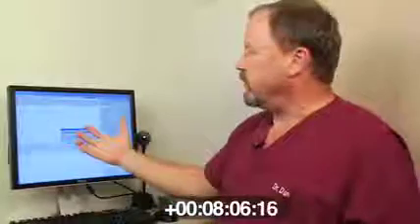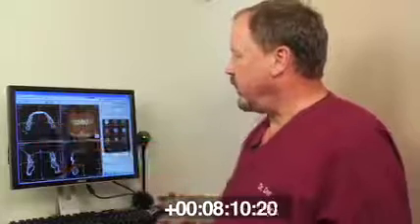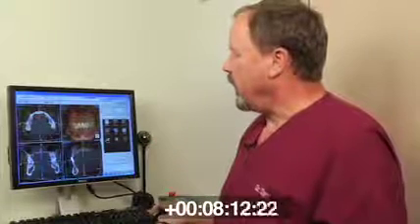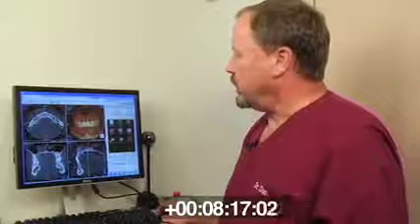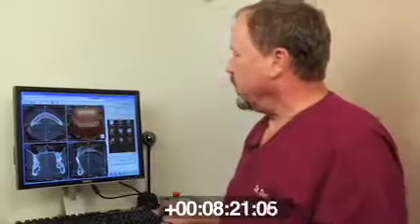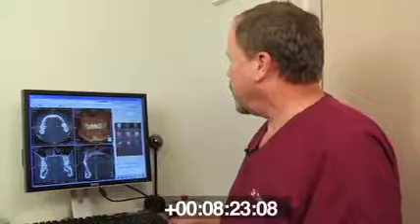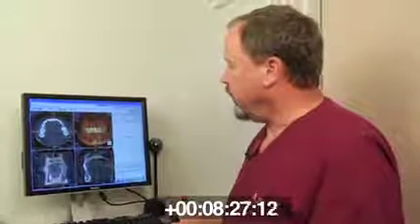And this is the advantage of having really nice software, because right away these images pop up, and you're able to just go through the image top to bottom. We just got Vince out of there. The chair is probably still warm. So here we go head to toe here. And this is back to front, and on this slice side to side.